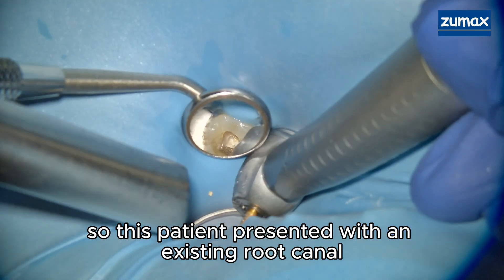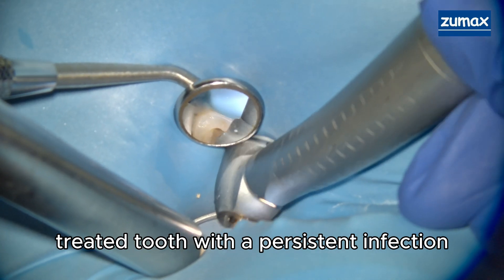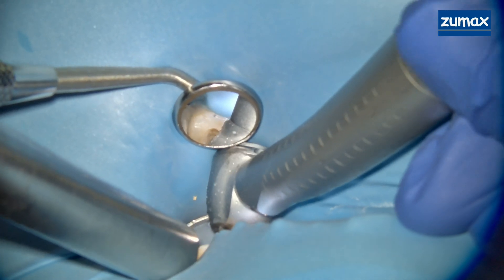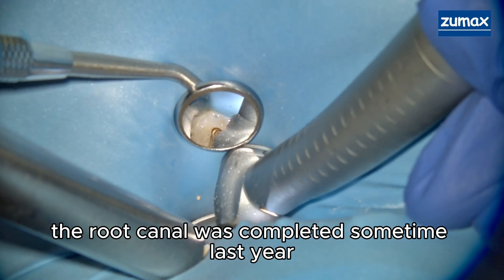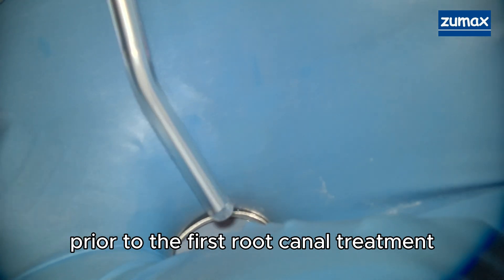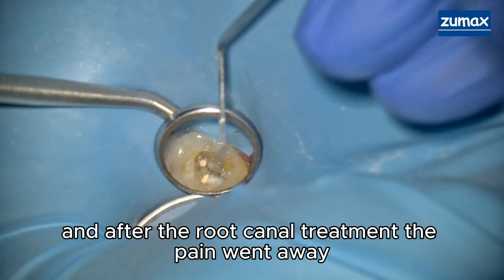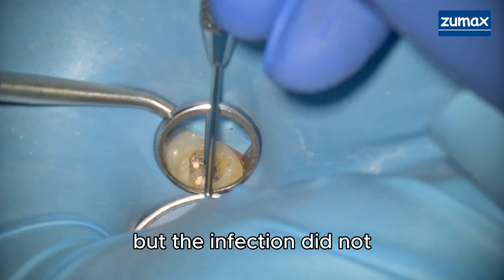This patient presented with an existing root canal treated tooth with a persistent infection. The root canal was completed sometime last year overseas. The patient had a lot of pain prior to the first root canal treatment, and after the root canal treatment the pain went away but the infection did not.